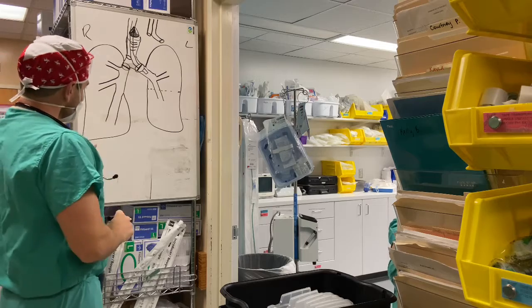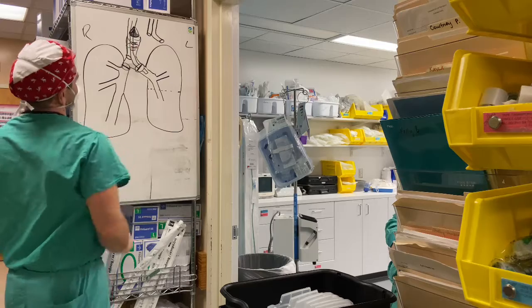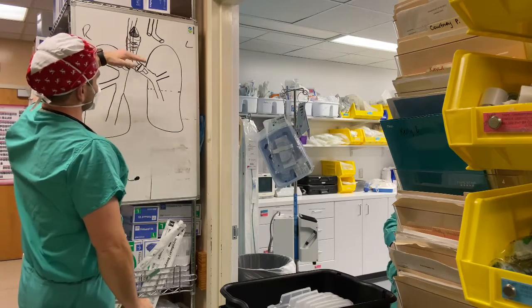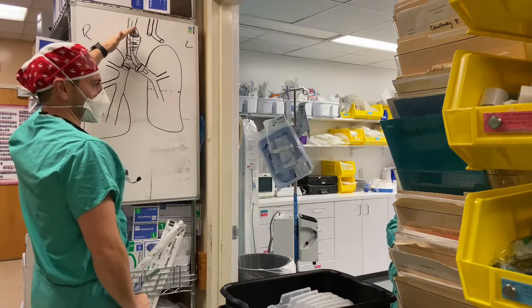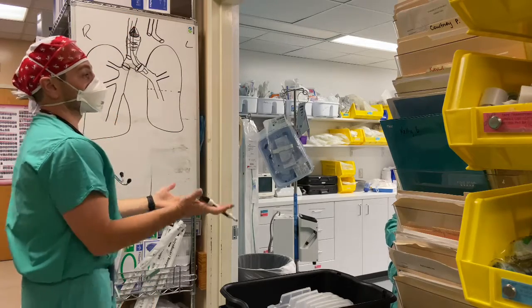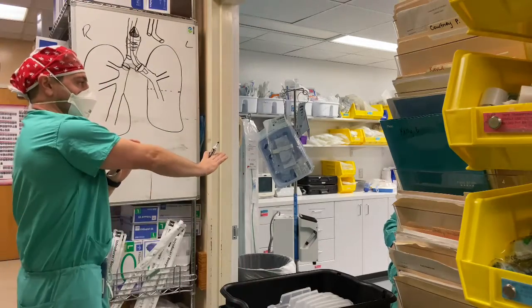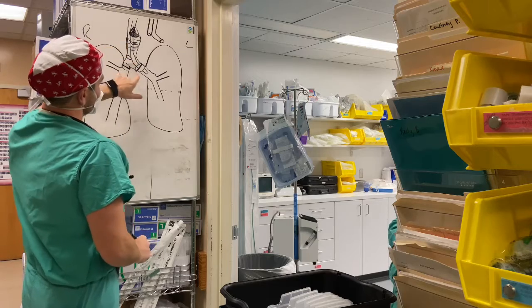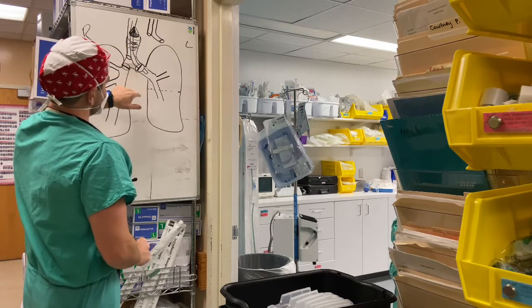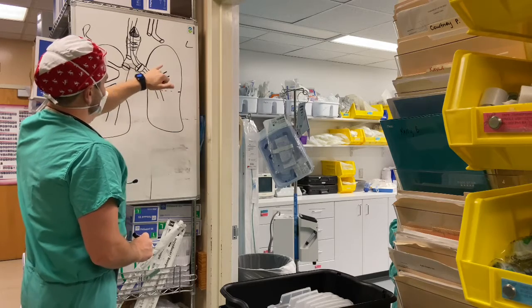So there's two balloons on a double lumen tube. There's a tracheal balloon, which just allows you to isolate everything that's above the airway from everything that's below. Like a normal single lumen breathing tube, I inflate that balloon so I can push positive pressure air in without it all leaking out. That's what this is for. The balloons that are down here, depending if you're using a left-sided or a right-sided tube, are just to isolate one lung from the other.